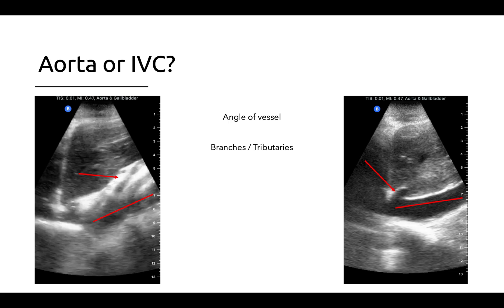Finally, notice that you can clearly see the IVC emptying into the right atrium here, whereas the aorta can be seen diving posterior to the mediastinum but does not actually connect with any of the chambers of the heart, as its connection to the left ventricle is actually located on the other side of the heart.